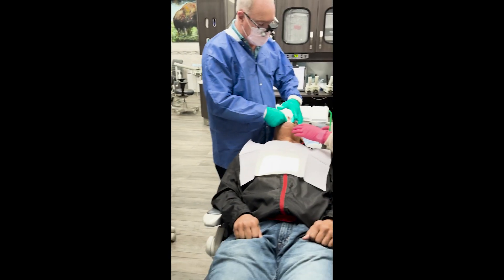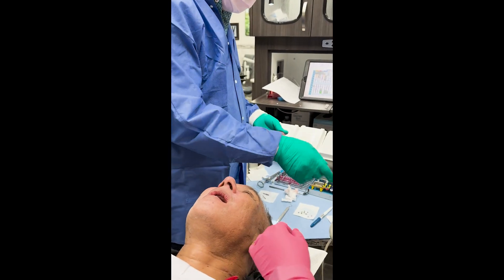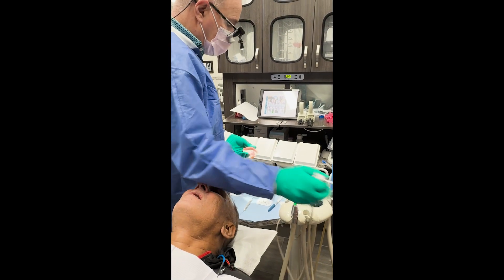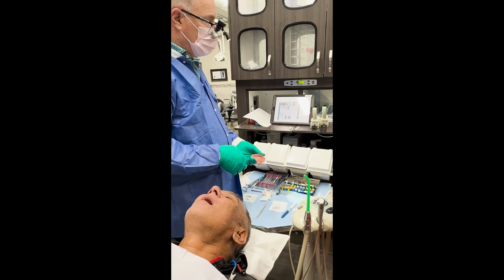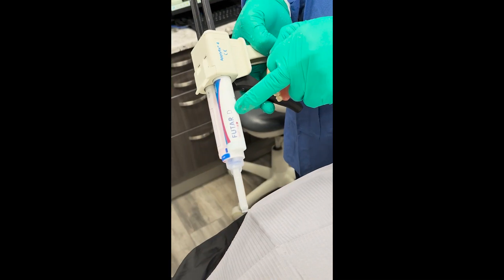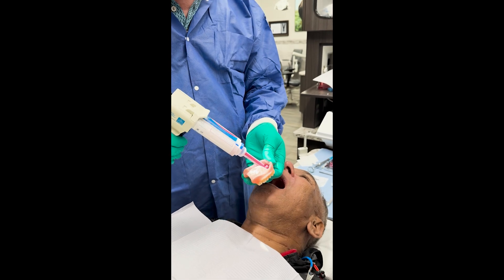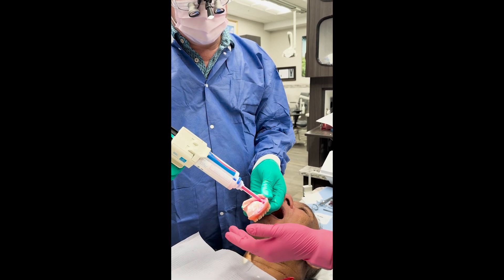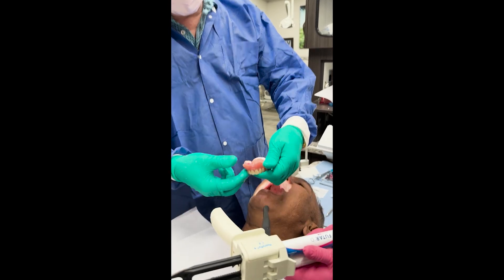The denture is all the way up — I can feel it because it's not rubbing on the implants anymore. We're going to use a product from Kettenbach called Futar. It's a fast-setting pink material and it's very hard. It'll hold this denture in place nicely while it heals. We're going to put that in there just like that — seat it right away because it sets up very quickly.